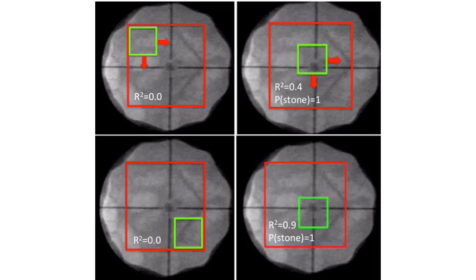Can we pause here for a moment? I want to clarify the scanning function. Is it correct that the template matching function calculates the R-squared value for each position within the red box? That must be very computationally intense, right?